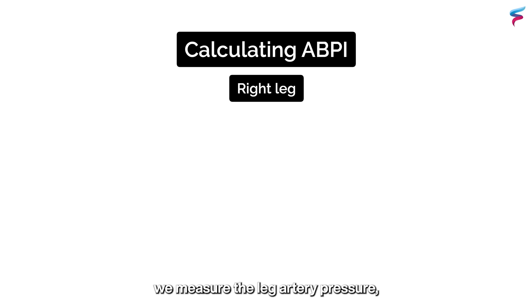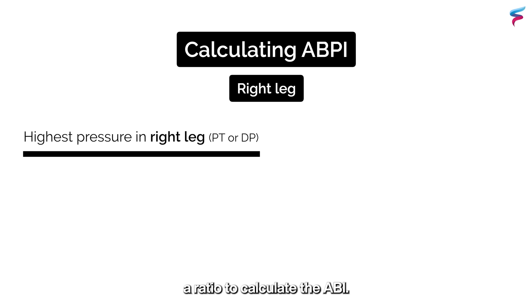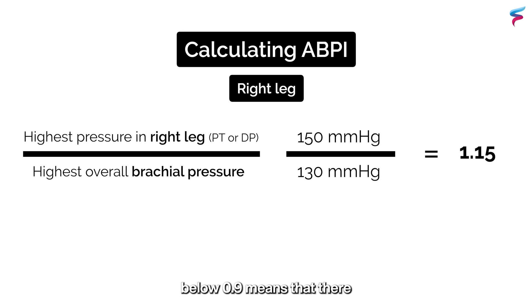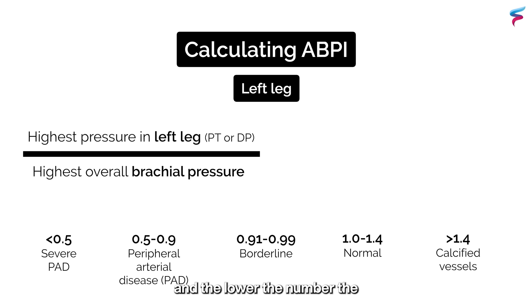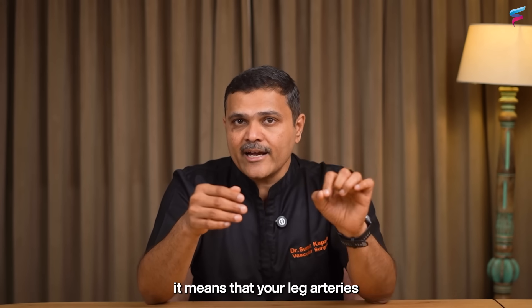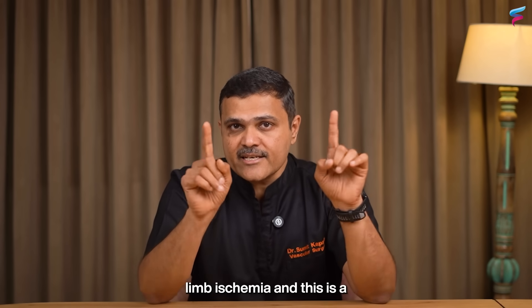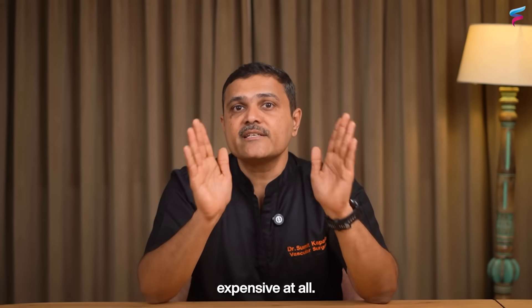When we do an ABI, we measure the leg artery pressure and the arm artery pressure and use a ratio to calculate the ABI. A healthy ABI ratio generally falls between 1 and 1.4. Anything below 0.9 means there is some blockage in the arteries, and the lower the number, the more severe the problem. If it goes below 0.5, it means your leg arteries may have something called critical limb ischemia. This test does not require complicated or expensive equipment.